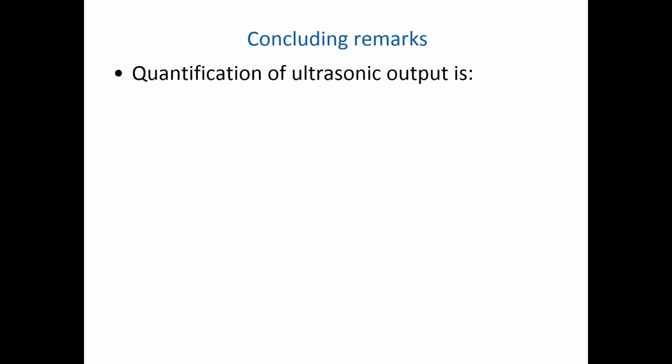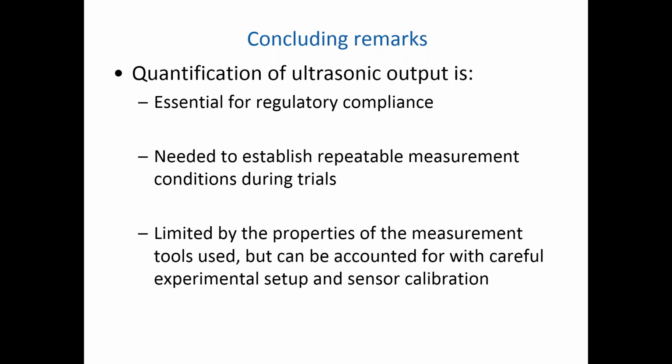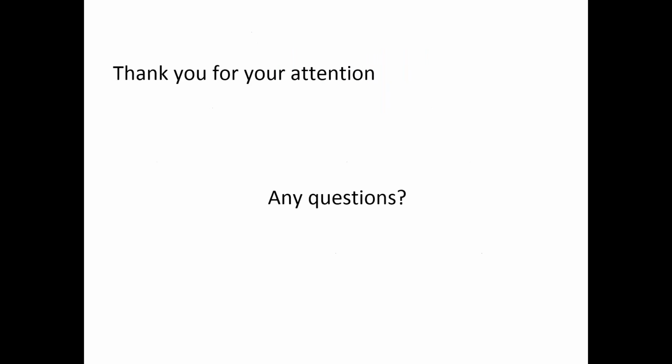So I conclude by saying that quantification of ultrasonic output is essential for regulatory compliance. It's needed in order to establish repeatable measurement conditions when we're undertaking trials. And whilst it's limited by the properties of measurement tools used, it can be accounted for with careful experimental setup and with sensor calibration. At this point, I thank you all for your attention, and I open the floor for questions.